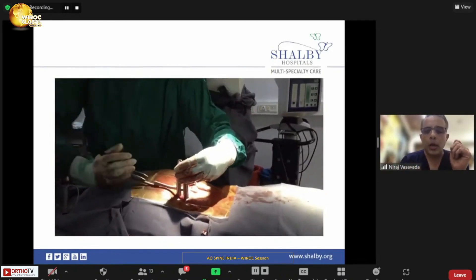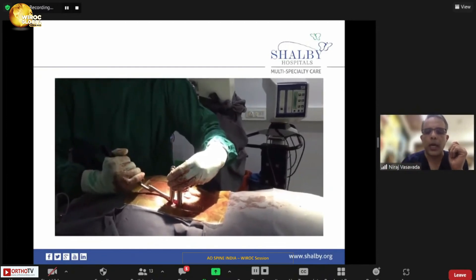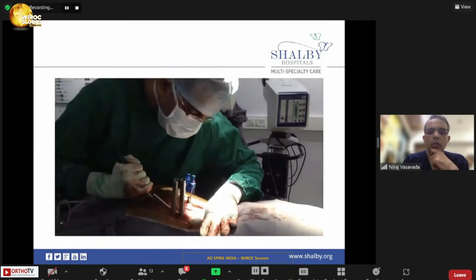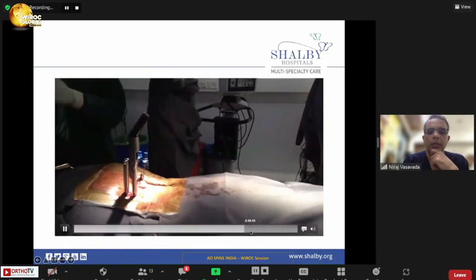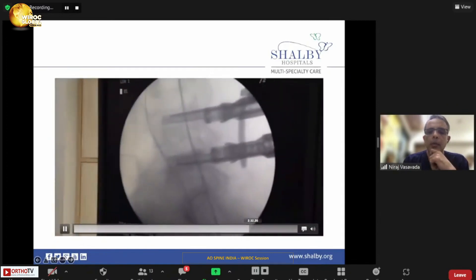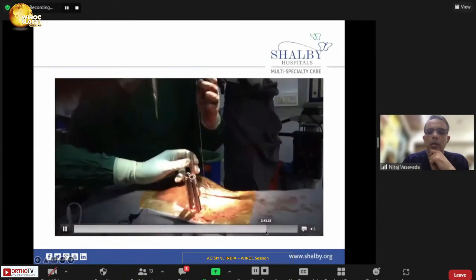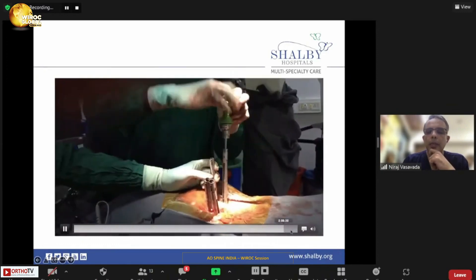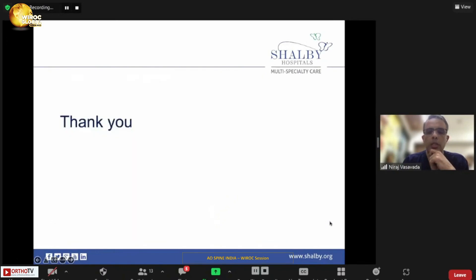Once all screws are inside, use your system to put the rod. You can then use compression or distraction as needed. This is the final placement of the rod. Put the same things on the opposite side in a similar way, and put the rod from the center in the same session.